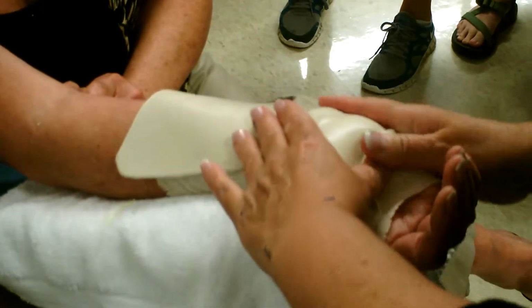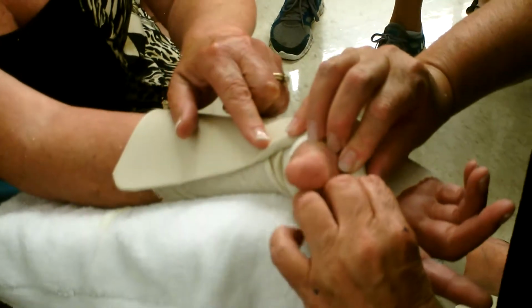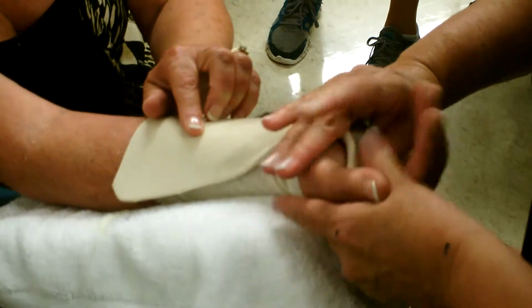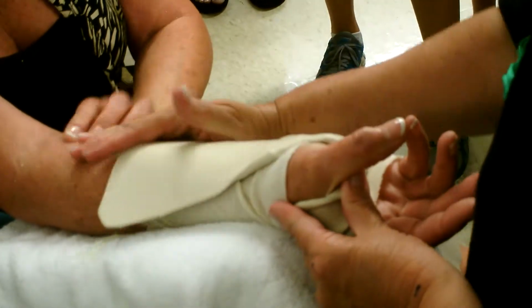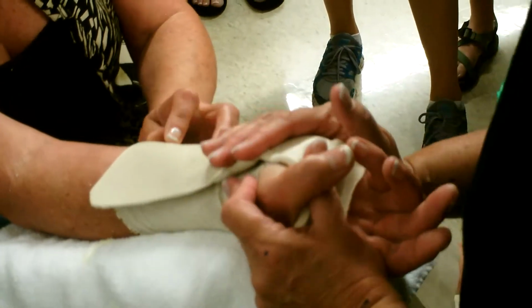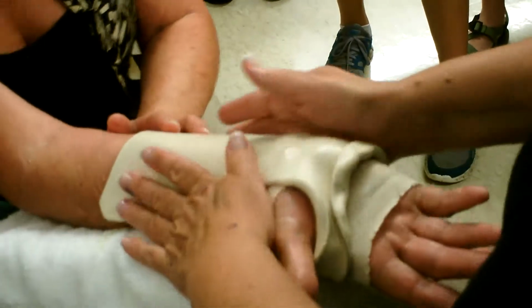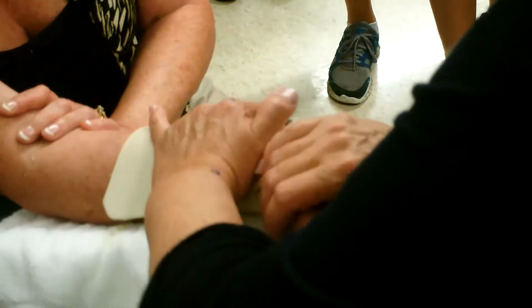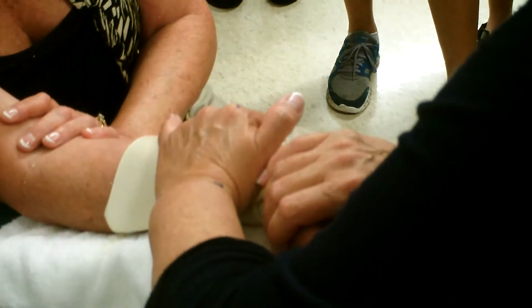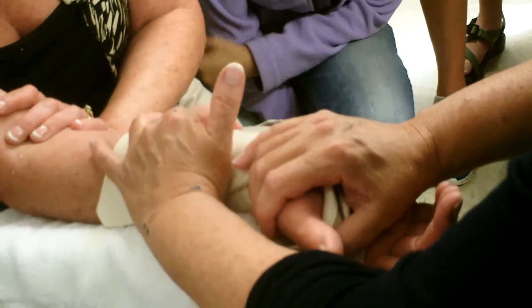You want to make sure you get the thenar. You've got to have this web space so she can still use her hand. And so we're kind of just doing this kind of movement. Relax your hands, patient. Now, sometimes the patient tries to help you too much. This is a good time to interview the patient and say, Miss Rita, what do you like doing in your free time? What do you do?